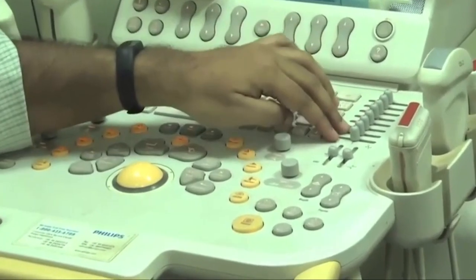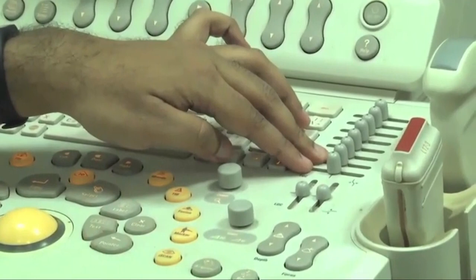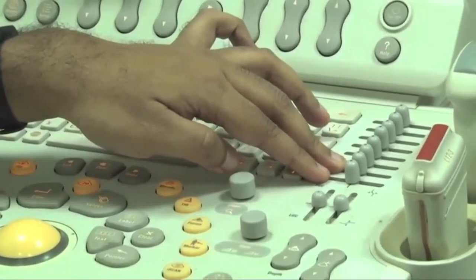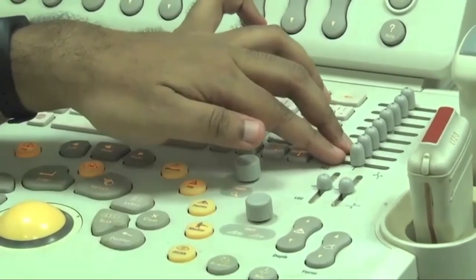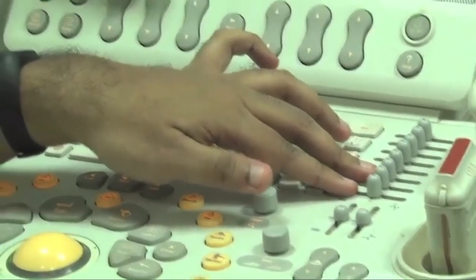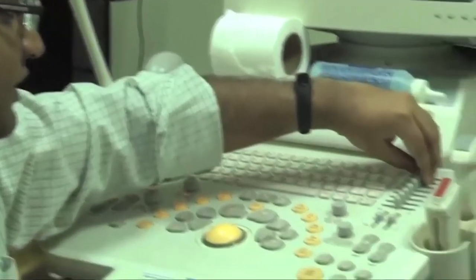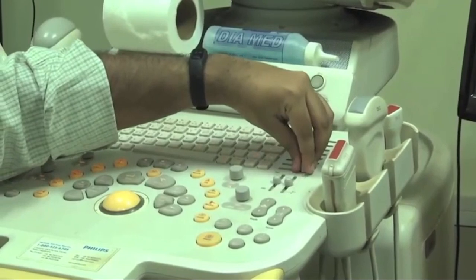The first one is called time gain compensation. Since ultrasound attenuates as it propagates, we have looked through those equations and the total derivation of how the energy attenuates as it goes into deeper tissue. For that reason, you have to amplify signals coming back from much deeper down. So basically you attenuate signals which are very close to you and amplify signals very far off from you.